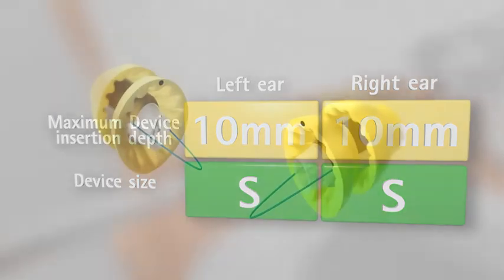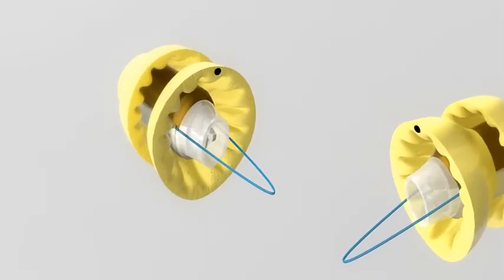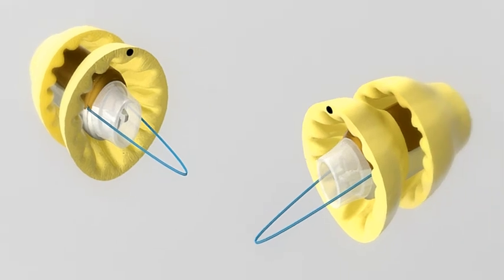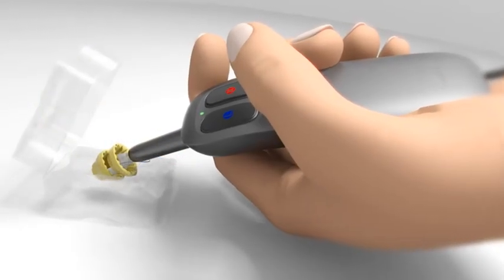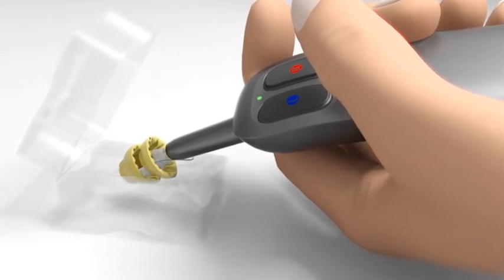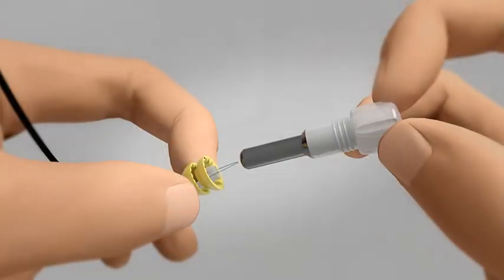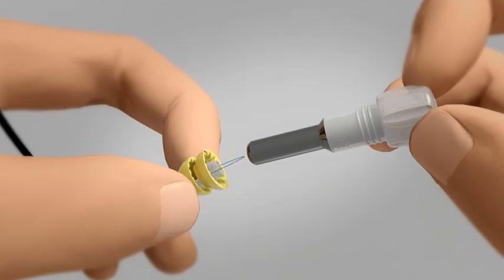You are now ready to insert the Lyric devices. The handling and insertion process for a device is identical to that of a sizer. Before inserting, program the device based on the patient's hearing needs using the fitting software and the programming wand. Hold the programming wand close to the device while sending the setting. Check the successful operation of the device after programming using the sound link.